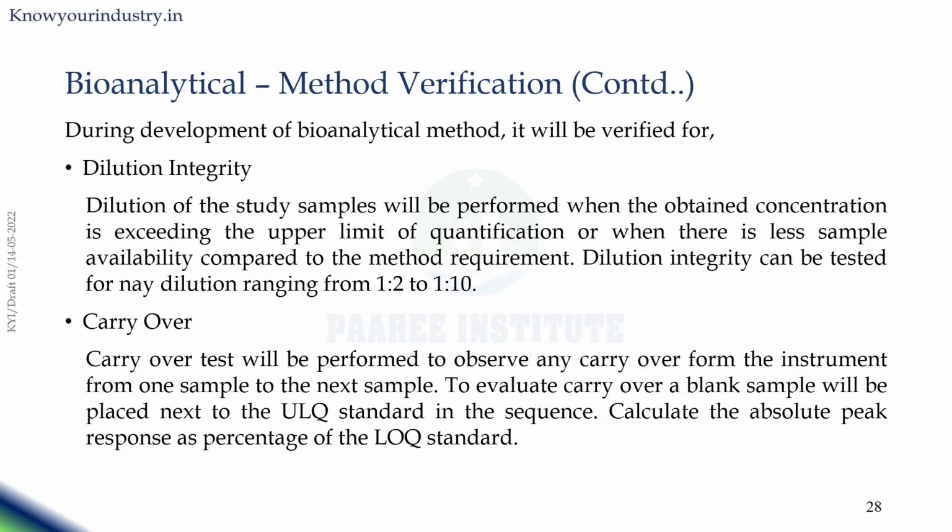Or if you need 0.5 ml of the plasma for the analysis, but you have only 0.1 ml, in that case also you can dilute the sample and analyze. For that, the integrity of the samples after dilution needs to be proven during the validation stage.